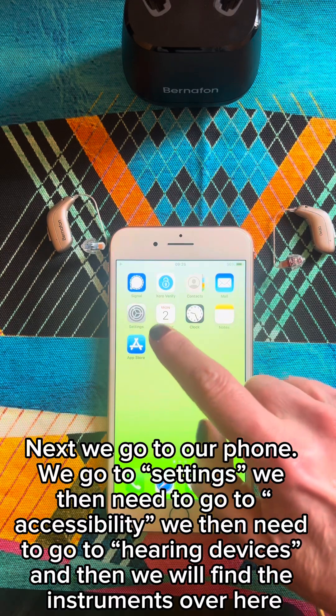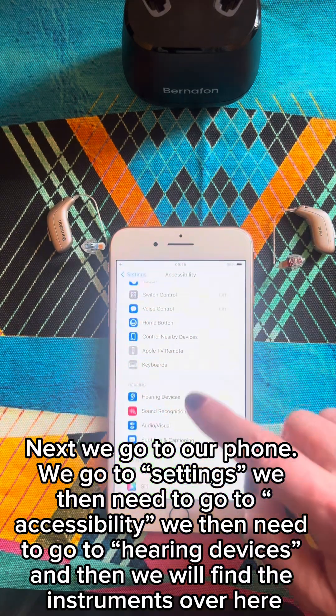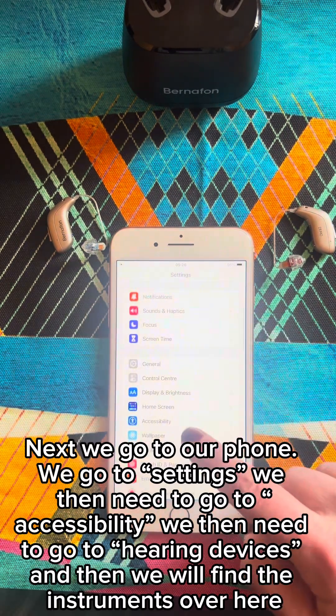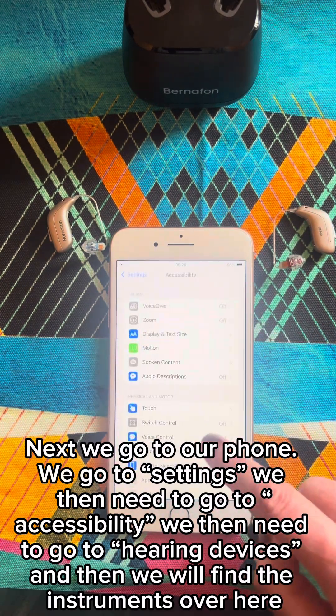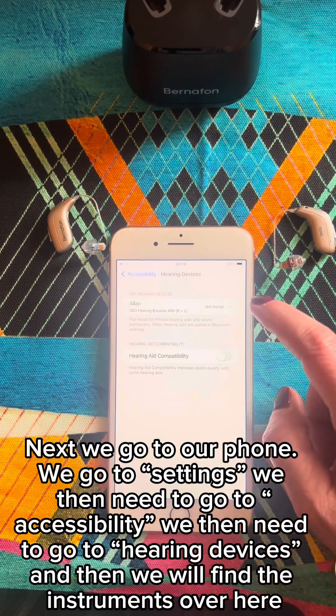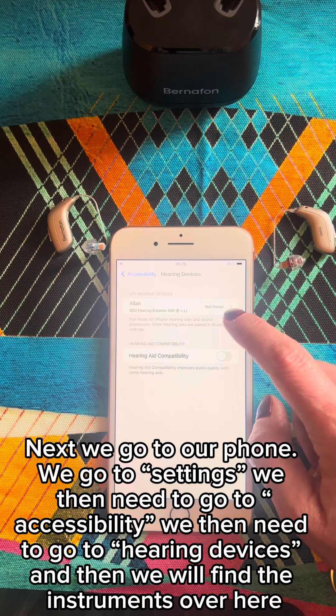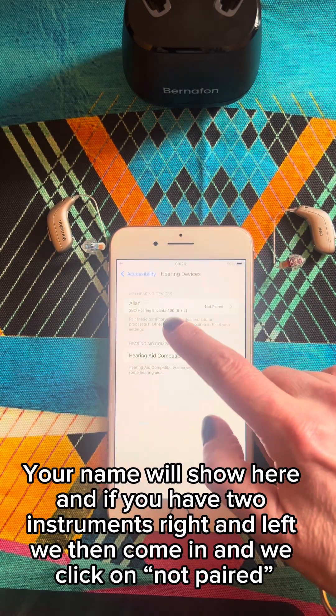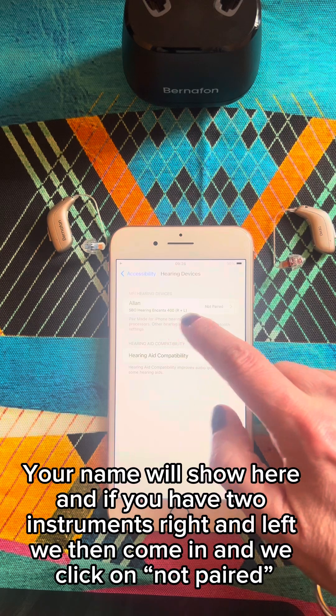Next, we go to our phone. We go to Settings, then we need to go to Accessibility, then Hearing Devices. And then we will find the instruments over here — your name will show here.